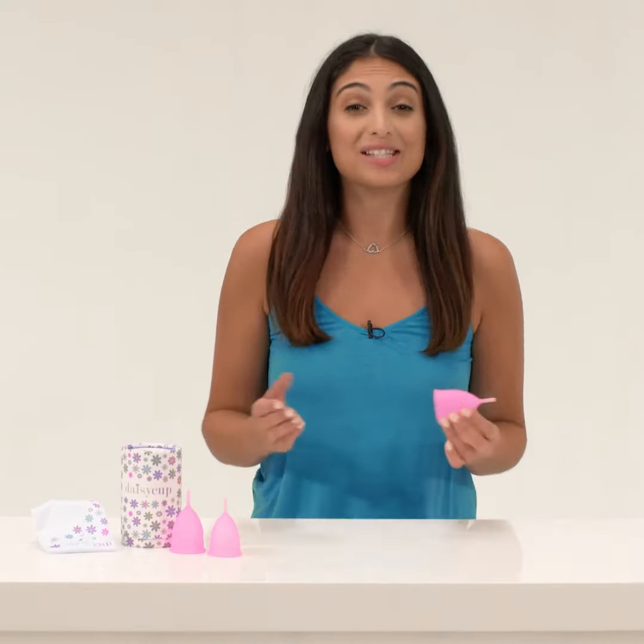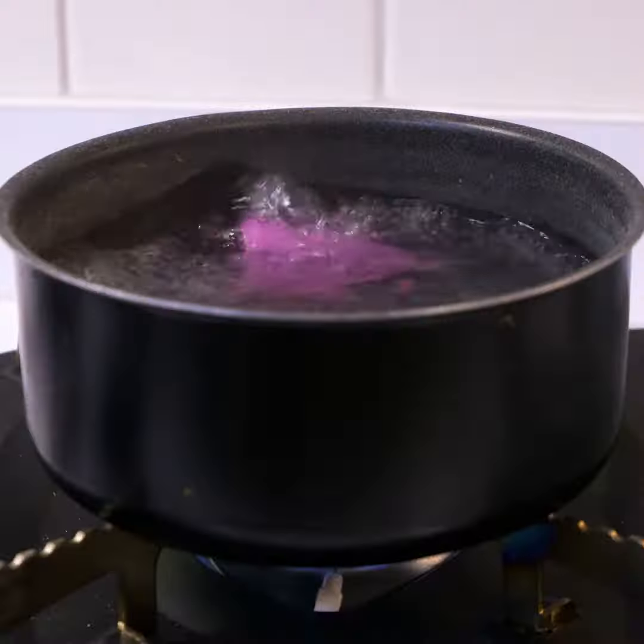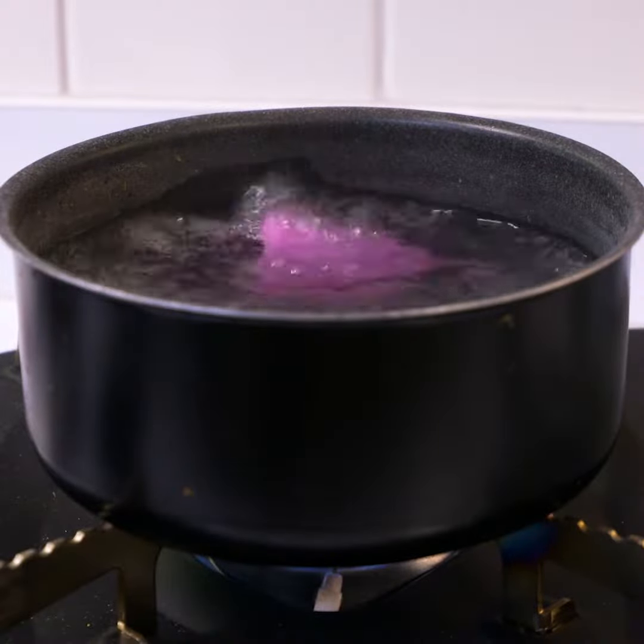To use your new Daisy Cup, follow these simple directions. Step 1, sanitize. Before using Daisy Cup for the first time, make sure you boil it in a large pot of water for 3 to 5 minutes.